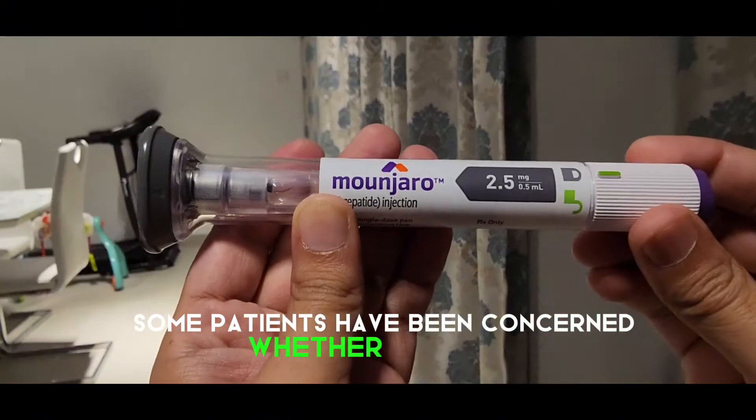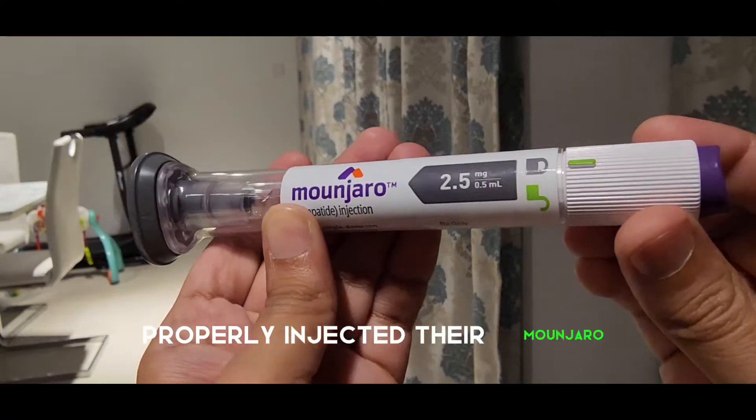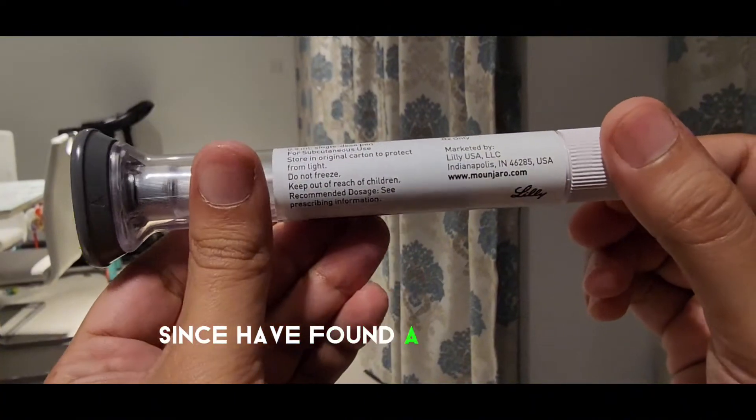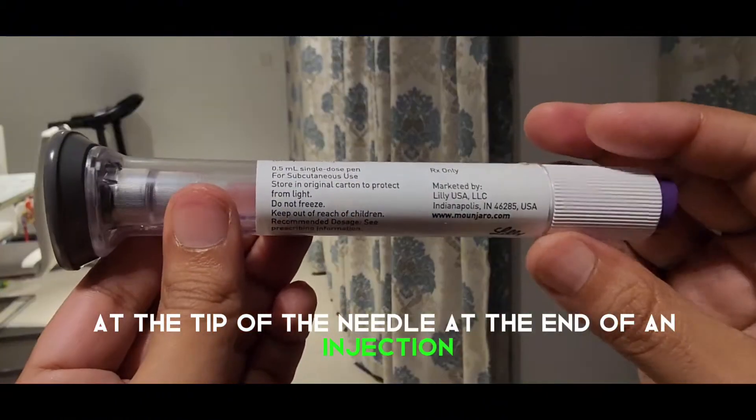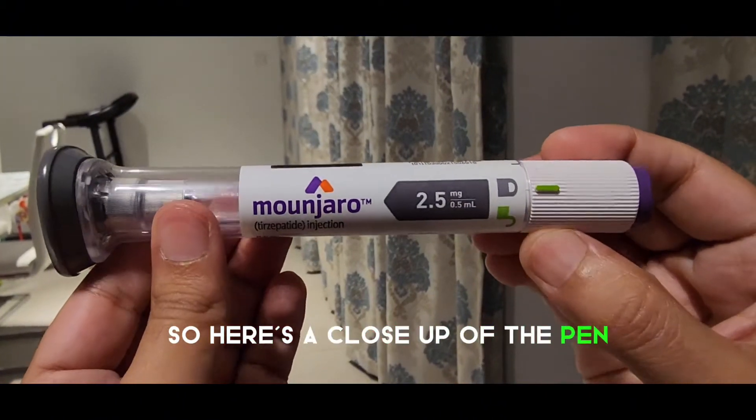Some patients have been concerned whether they have properly injected their Mounjaro, since they found a drop of drug at the tip of the needle at the end of an injection. Here is a close-up of the pen.